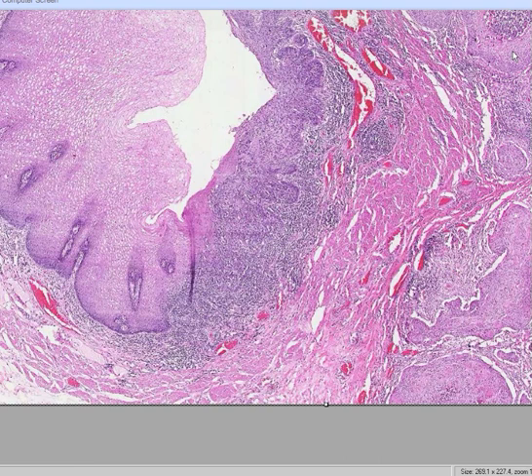Let's say this wasn't a squamous cell carcinoma of the esophagus, which most of them are. Let's say it was the second most common type, which is adenocarcinoma. Let's just say that theoretically. Well, if it was an adenocarcinoma of the esophagus rather than a squamous cell, would it most likely arise from the lower part of the esophagus or the upper part of the esophagus? Of course, lower is correct.